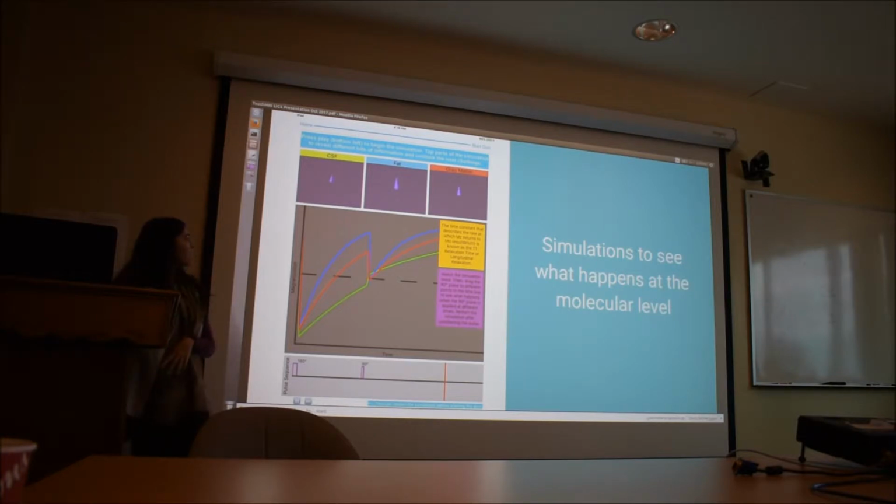In this specific case, we have 3 different cones, and the cones represent the magnetization vectors within your body. By magnetization vectors, I mean the sum of all the magnetization vectors of the protons in your body. There are different amounts of protons in each type of tissue. For example, the CSF, which is cerebrospinal fluid, will have a different amount of protons than fat or gray matter. And so the way the magnetization vectors change in each type of tissue varies.